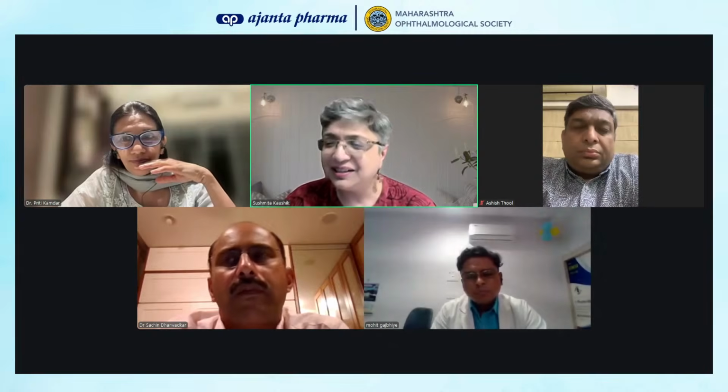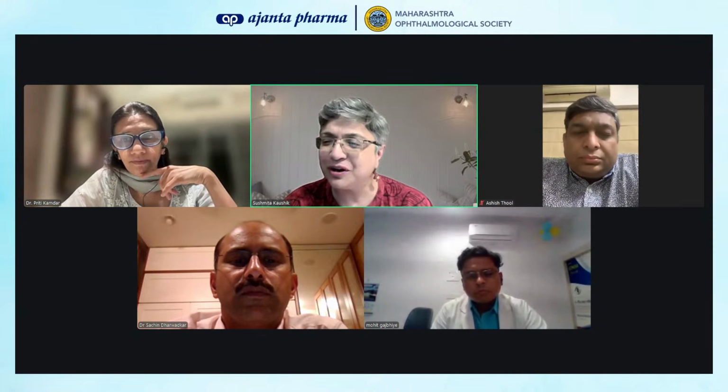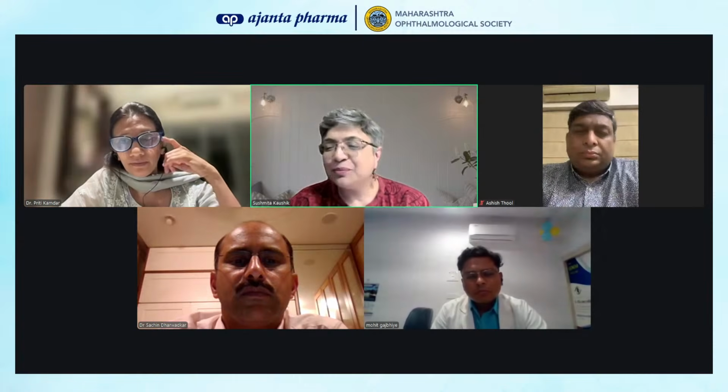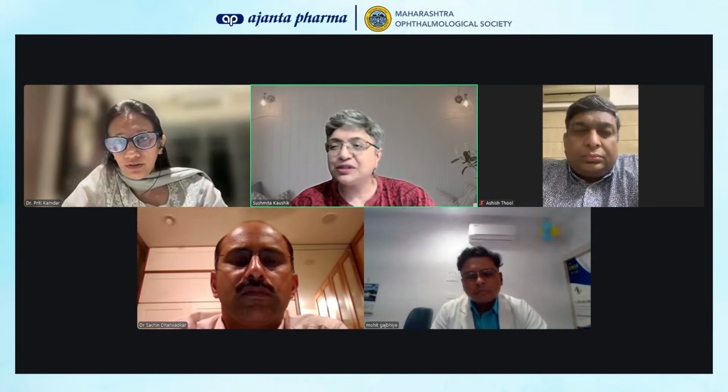So have everything else in mind: your fields, your pressures, your gut feeling. The patient itself will tell you, "मजा नहीं आ रहा, अरे 6/6 revision." "नहीं, वो ठीक है, but that subtle contrast, the subtle change. I used to be able to go out at night for a late evening walk. I'm scared now." So बहुत clues come in. So I don't rely on OCT as a progression tool, really.